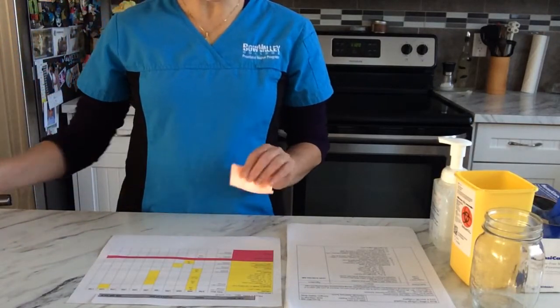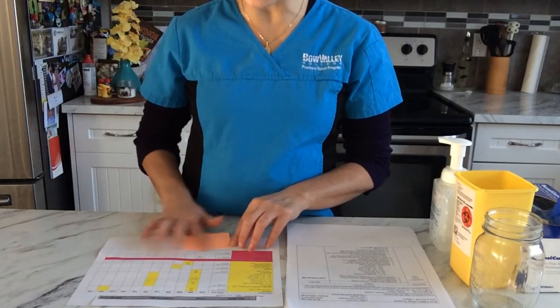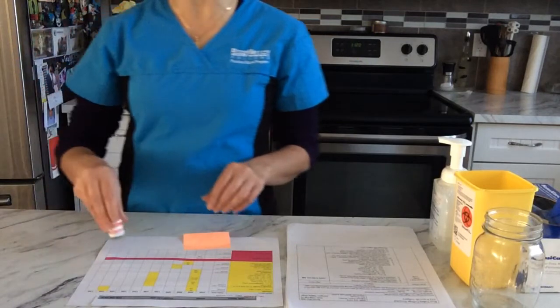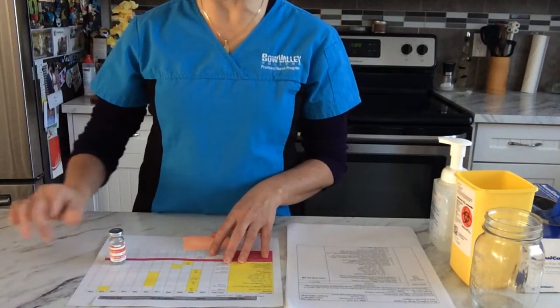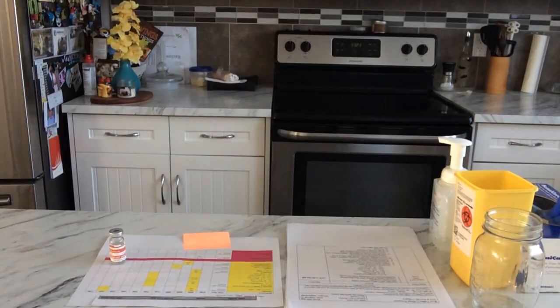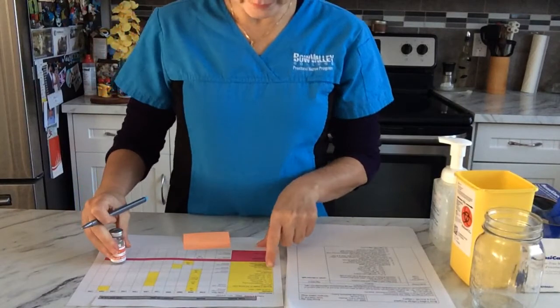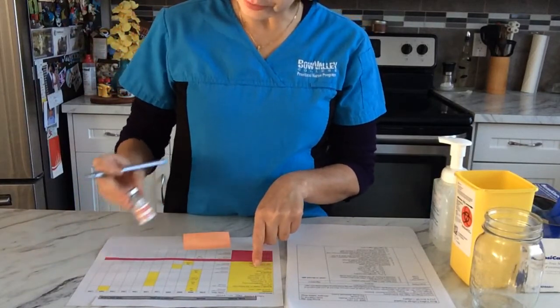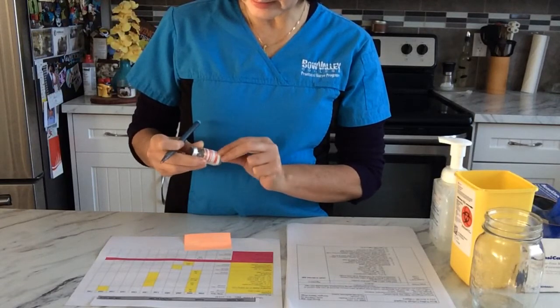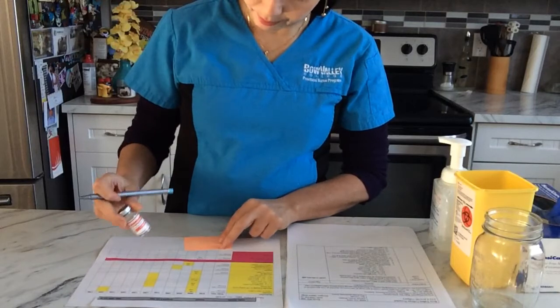So I'm gonna see how much is 5000 units. I'm gonna grab my supplies here. I have the vial. This is a practice vial. So the doctor ordered 5000 units subcutaneous. I have in the vial 10,000 units heparin sodium.